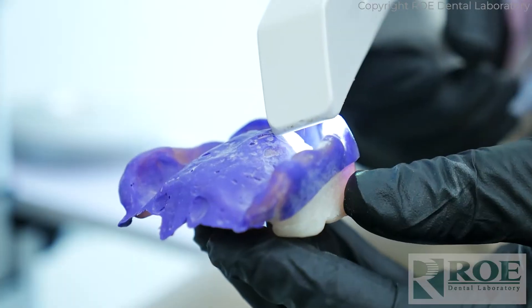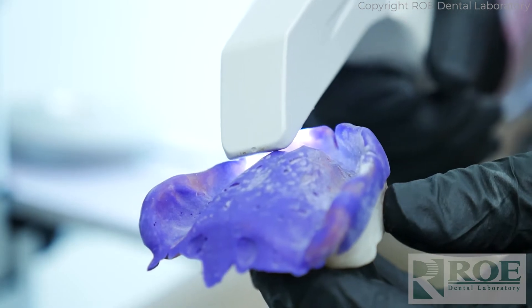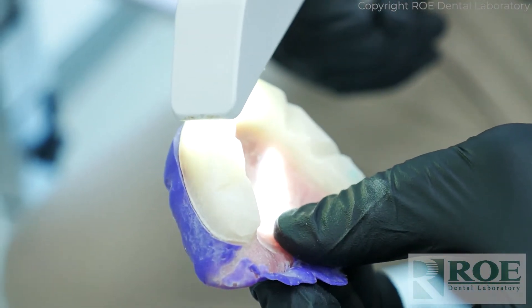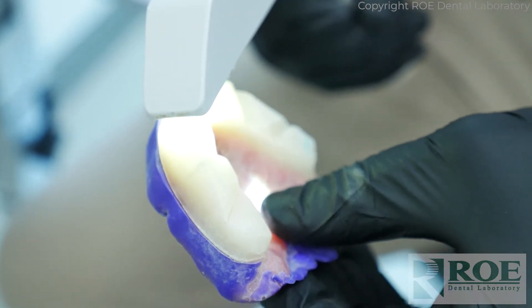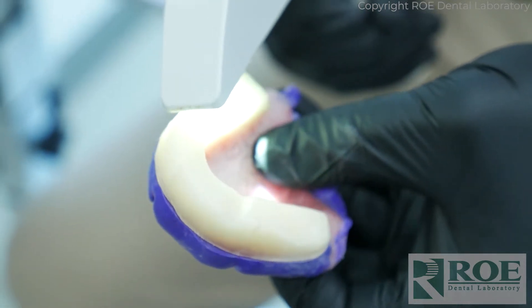When you scan bite blocks with your iOS scanner, you'll follow some tips and tricks from our videos. Essentially, you'll scan the intaglio first, then roll around to the borders, then roll around to the labial parts of the teeth and the occlusion, and a little bit of the lingual of the bite rim. You don't need to capture the entire palate — we can create the post-palatal seal and all areas except for the palate.